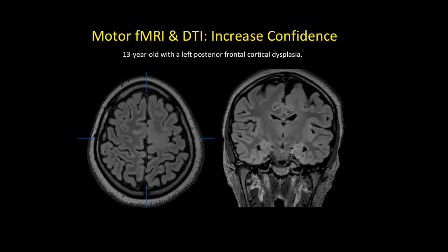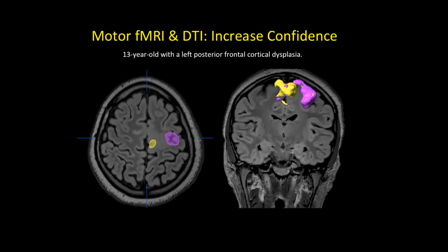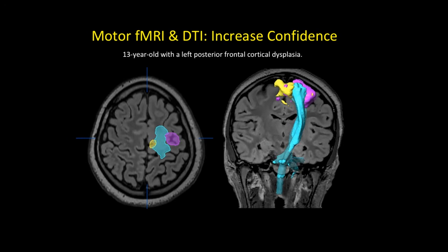Here is a case of a cortical dysplasia involving the left motor cortex and corticospinal tract. It is a good idea to overlay the tractography with your BOLD data in order to increase your confidence in your interpretation. If the BOLD regions overlap, we can be more certain that the motor tractography of the corticospinal tract is accurate, even in the case with abnormal cortical anatomy.